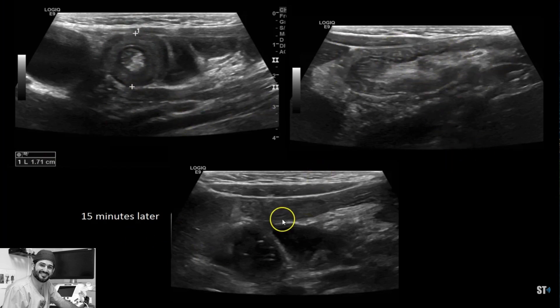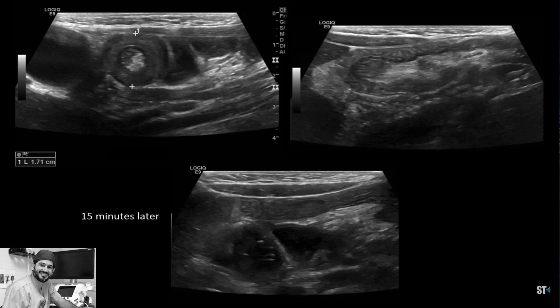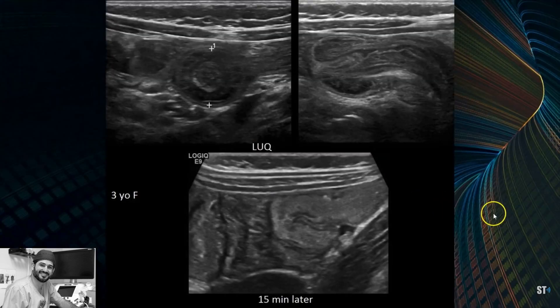Fifteen minutes later it was gone. So if you see a small bowel intussusception — especially in the left upper or left lower quadrants, midline, epigastric, or pelvic regions — just wait, measure it, put Doppler on it, and see if it goes away by itself. They typically do.